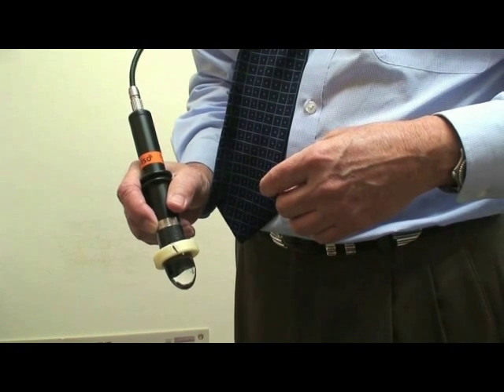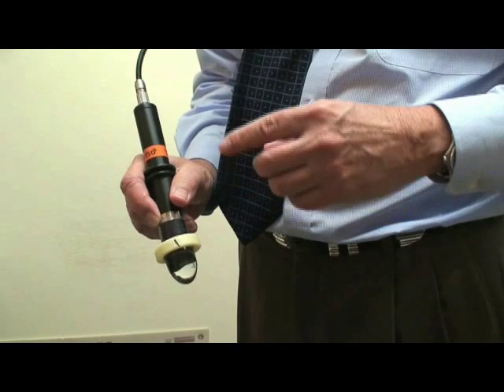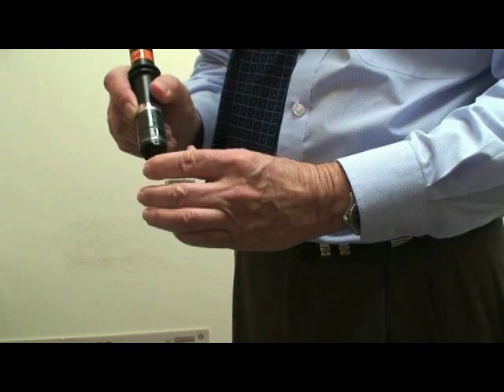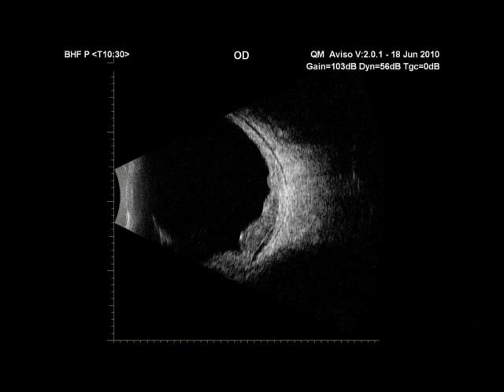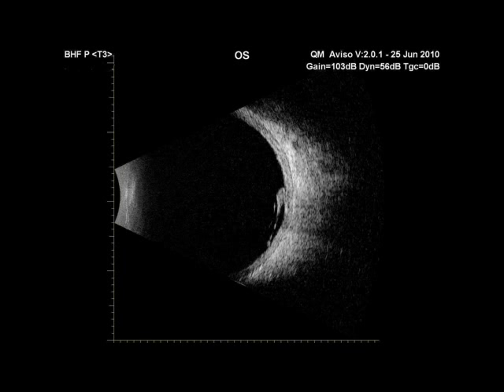Your first scan, regardless of the diagnosis, should be a transverse scan to determine if the fovea is intact. The fovea, responsible for detailed vision, translates to quality of life for the patient. The probe line faces the nose for the right eye in a transverse scan, with the transducer close to the limbus and sound directed toward the optic nerve. When performed correctly, the nasal retina is at the top of the screen, a black V — the optic nerve — is in the center, and just on the other side of the nerve is the temporal retina, the location of the fovea.